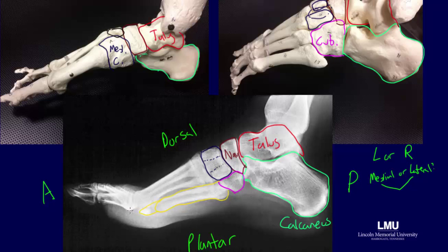The metatarsals and phalanges can only be evaluated in relation to one another or their overall shape in this view. Remember, at the end of your evaluation, you should have considered joint spacing for pathologies such as arthritis.